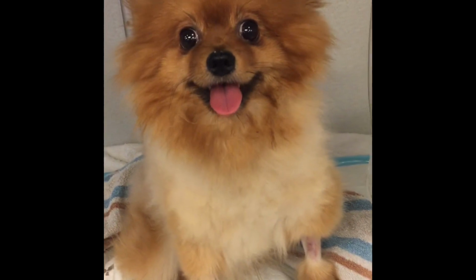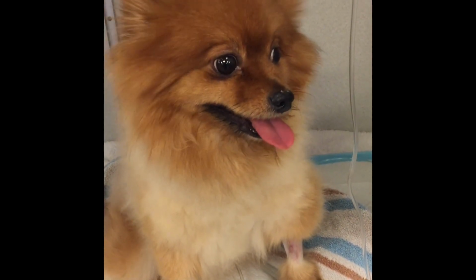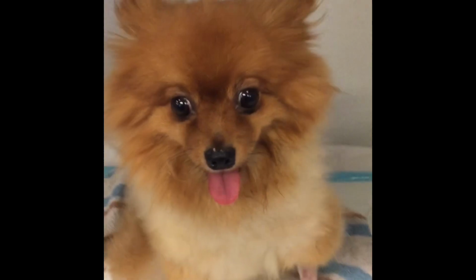Here is the same dog about 10 minutes after recovering from anesthesia. You will find that his breathing is much different.